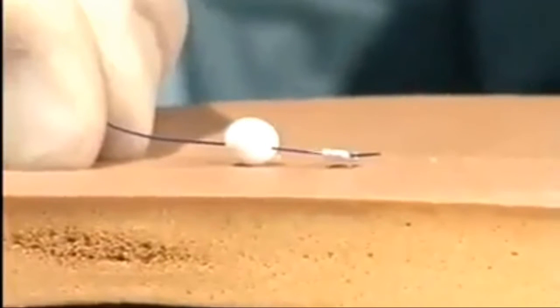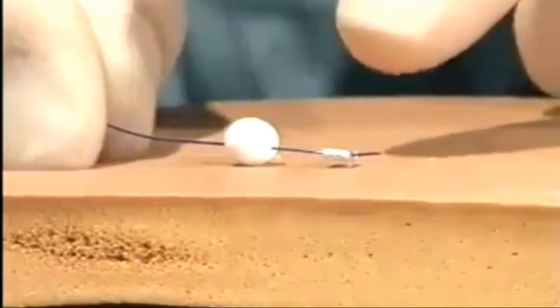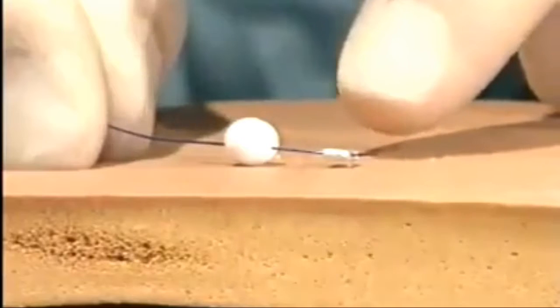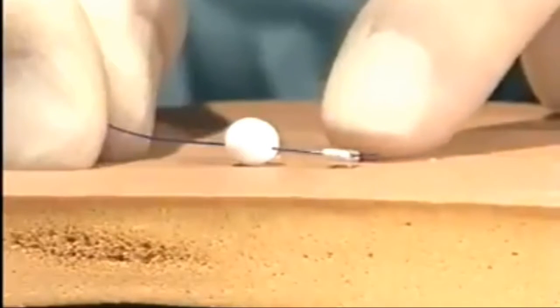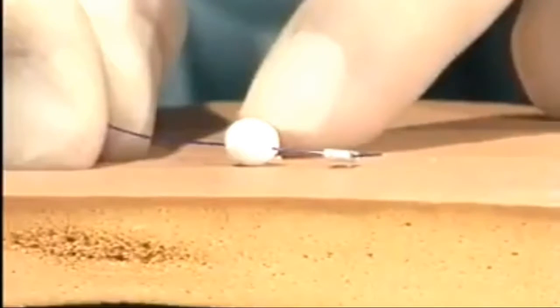For non-absorbable sutures, some surgeons like to use the collar and cuff technique. There is a crushed bead at one end, followed by a larger bead to stop the suture being pulled through the needle hole.